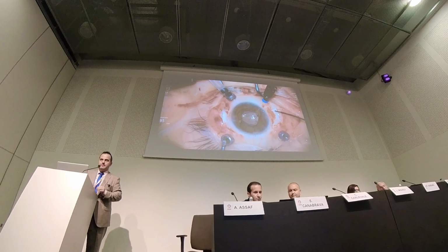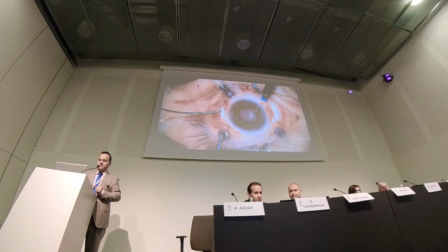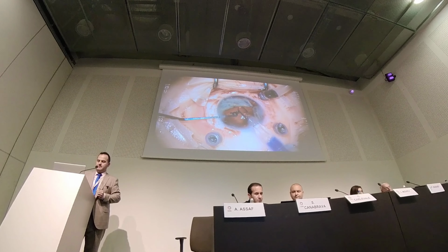The Gore-Tex is really elastic. You might cover it with the scleral. If you want, you can push it even into the eye, but I think it's not necessary.